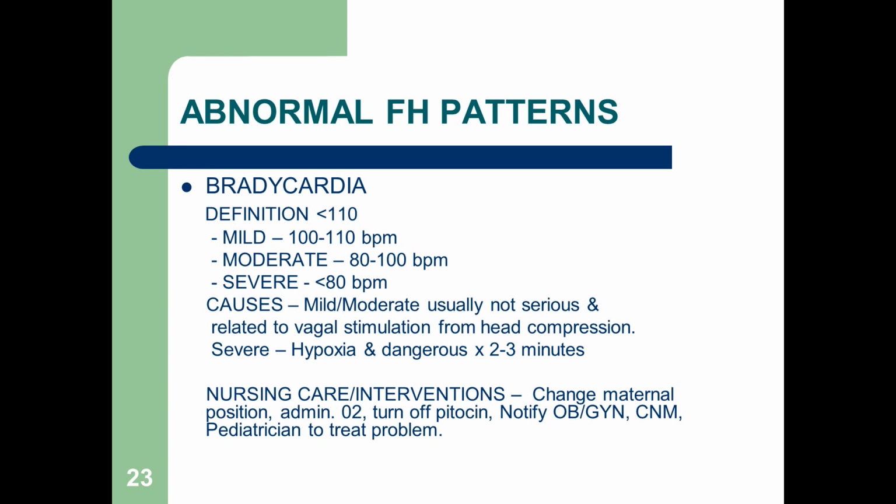Nursing care, certainly. Change the maternal position. You might administer O2, and if they're on PIT, you're going to turn it off. You're going to notify the doctor as well as the pediatrician for treatment. A heart rate that's too low or a heart rate that's too high is cause for concern. This baby is in distress, okay?